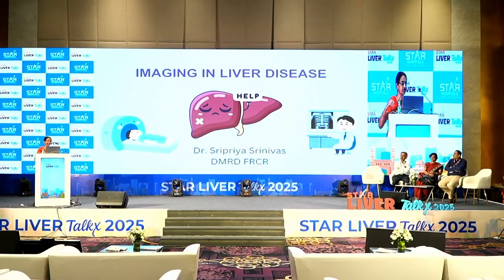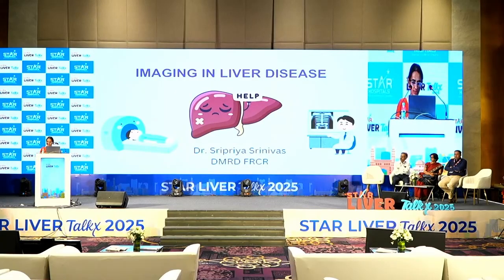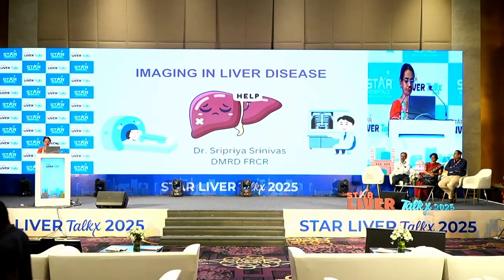Imaging in liver disease is a broad topic. So my aim here, since most of us are not radiologists, is to show you lots of pictures and explain them a bit as we go. And the running theme this time is about evaluating the complex liver recipient. So with a view to that, I'll proceed.